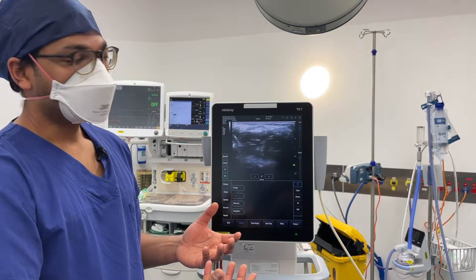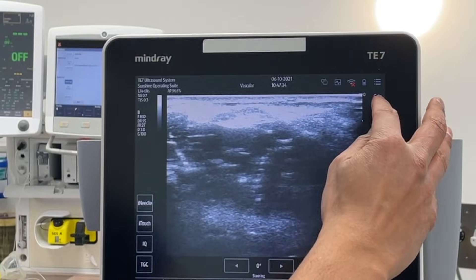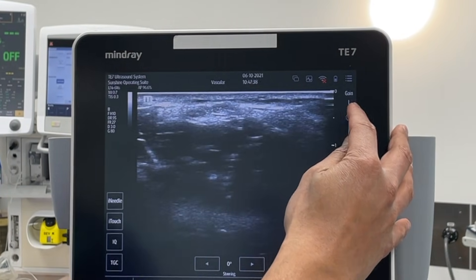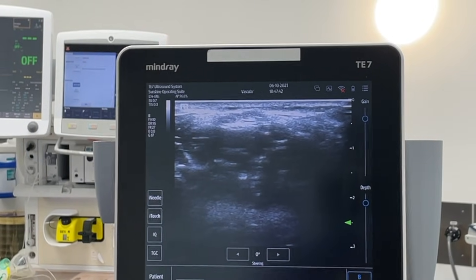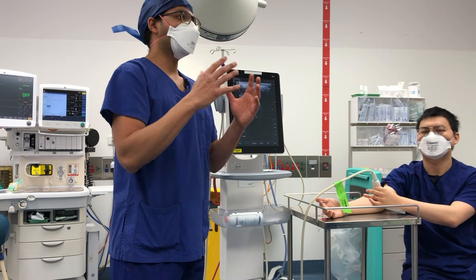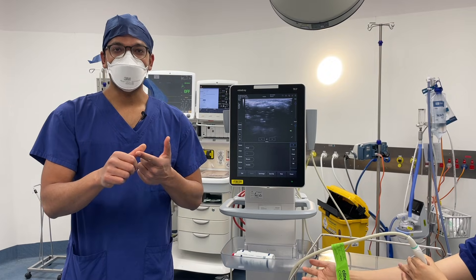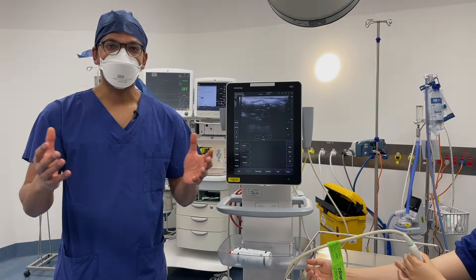Finally, gain is how much information is coming back — it makes your signal brighter or darker. Increasing gain makes the screen brighter; decreasing it makes it blacker. You just need somewhere in between so you can identify structures. That's PP-DFG: probe, presets, depth, frequency and focus, and gain.